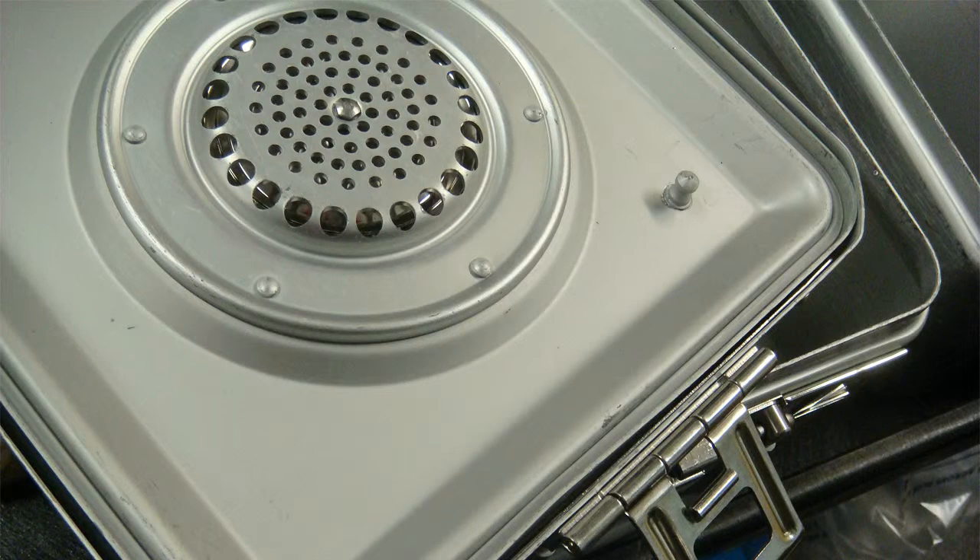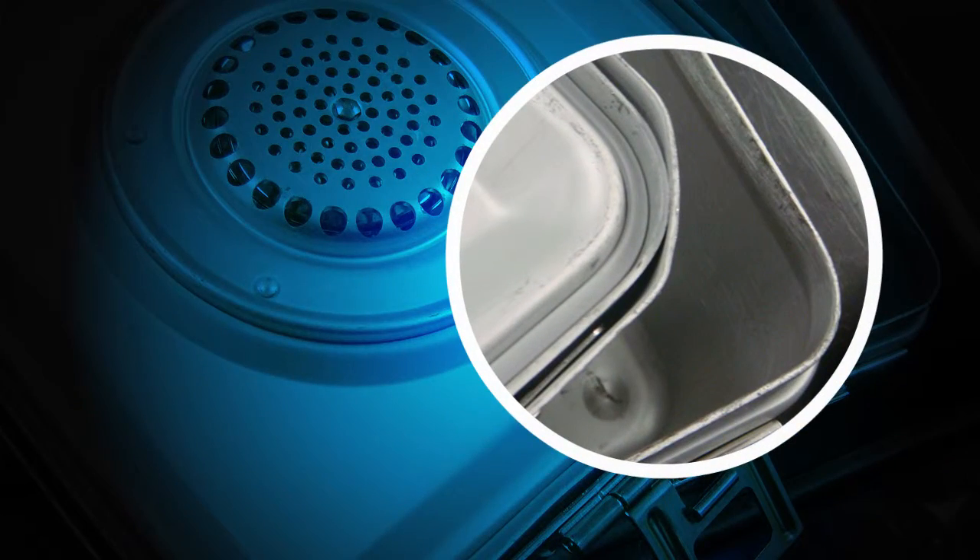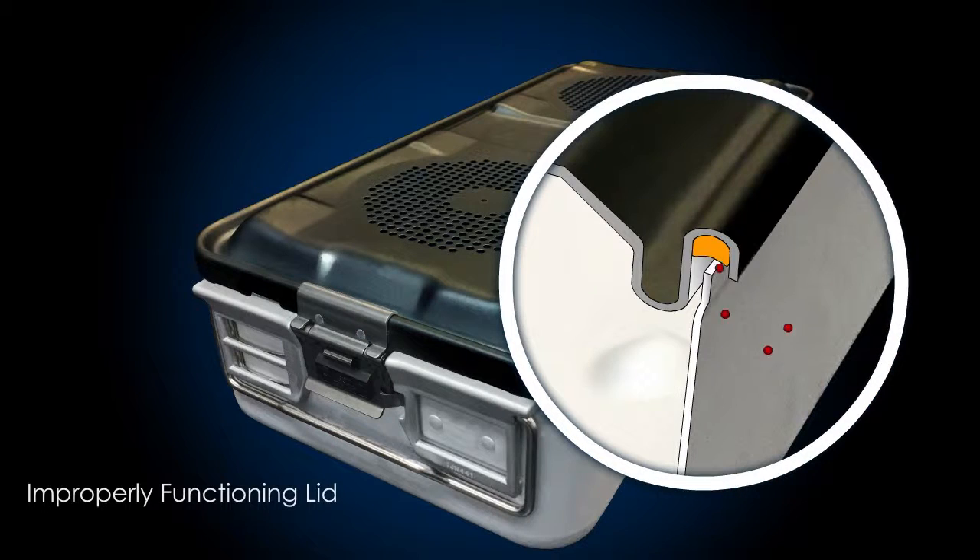However, damage, misuse, or poor construction can create breaches in the barrier where bacteria can enter. When the top and bottom do not achieve a proper seal because of damage, gasket damage, or other causes, gaps can be created providing an entryway for airborne contaminants.